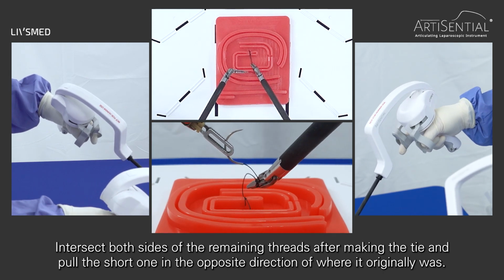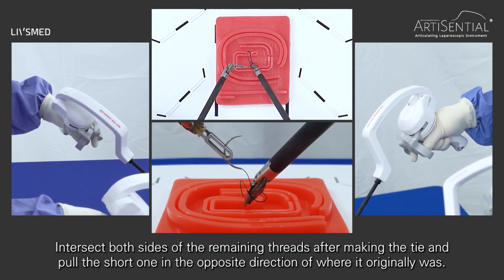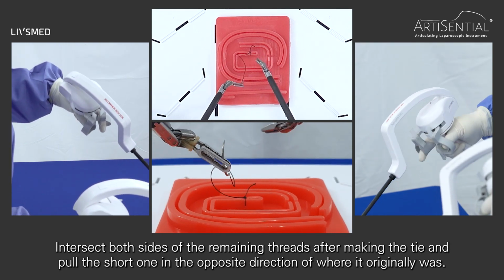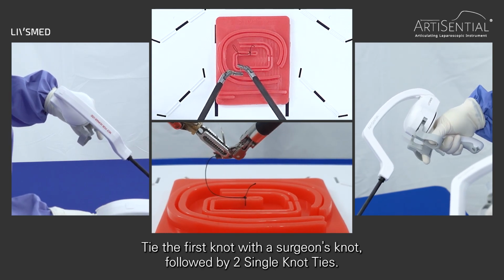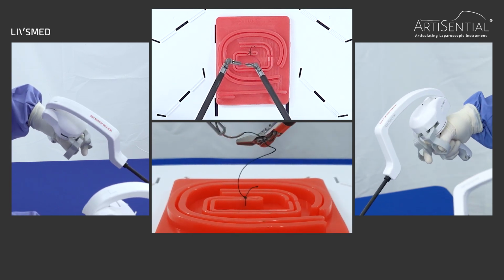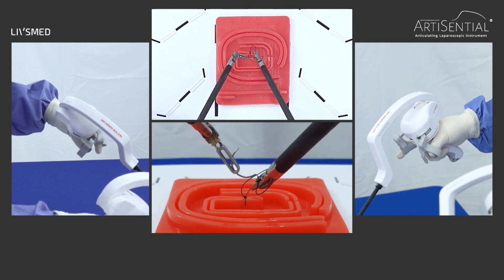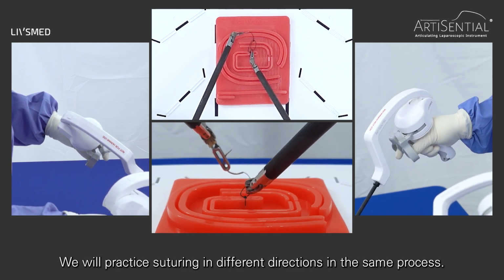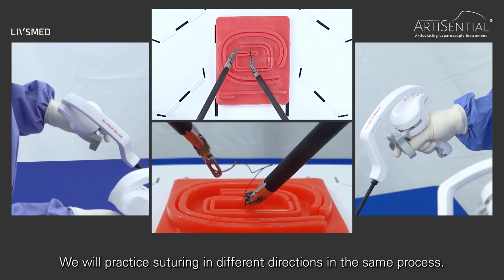Intersect both sides of the remaining threads after making the tie, and pull the short one in the opposite direction of where it originally was. Tie the first knot with a surgeon's knot, followed by 2 single knot ties. We will practice suturing in different directions in the same process.